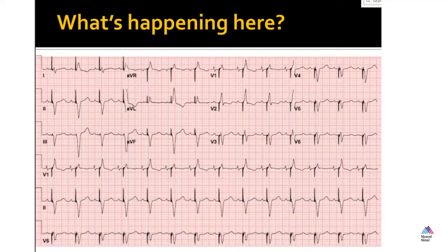Yeah, absolutely. That's an excellent question, Molly. You could definitely extend the PR interval or the AV delay to try and enhance the patient's own ability to conduct, right? Because as a general rule, we think you're hemodynamically going to be a little better if you're conducting on your own versus paced.